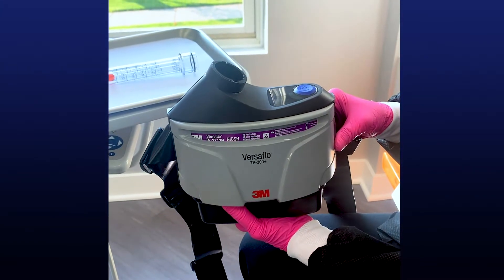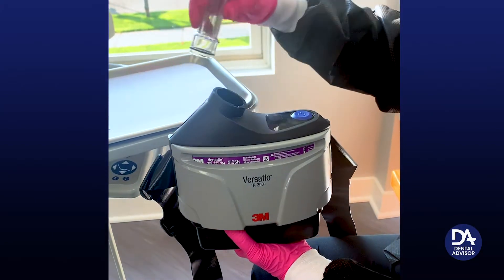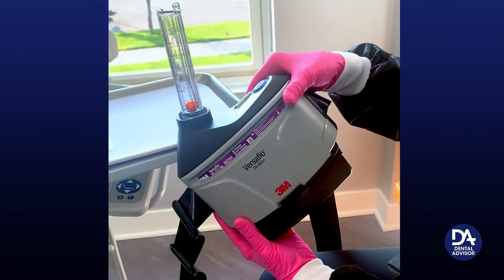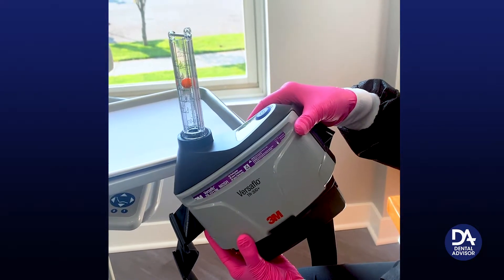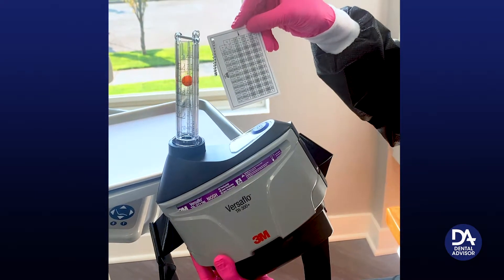Every day before you use the device, you need to make sure that the airflow is functioning properly. To do this, you attach the airflow checker and turn it so it's vertical. Turn the device on. It needs to remain on for one minute. Check the chart for the temperature and elevation.